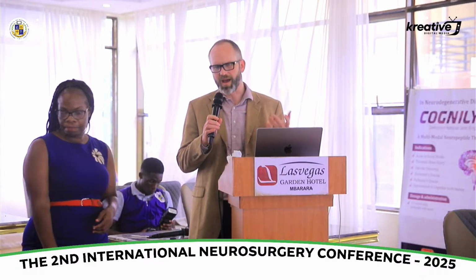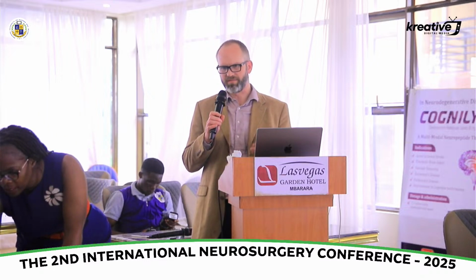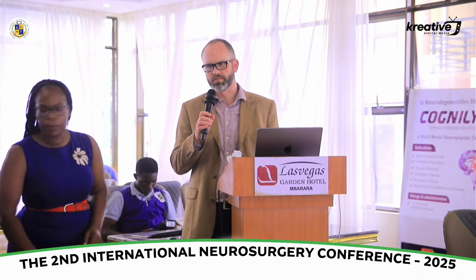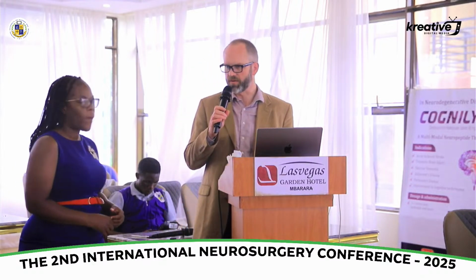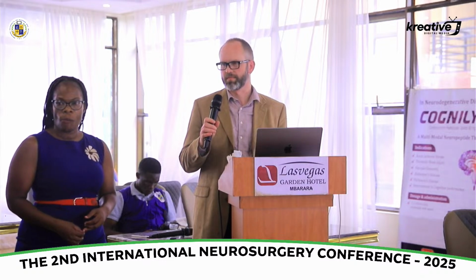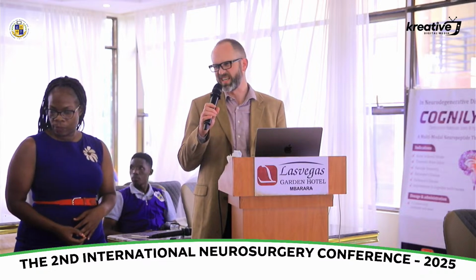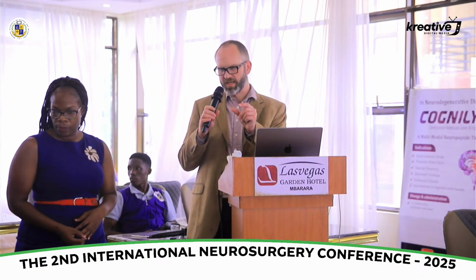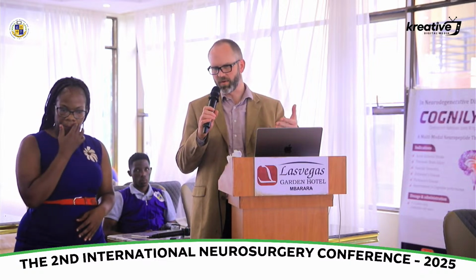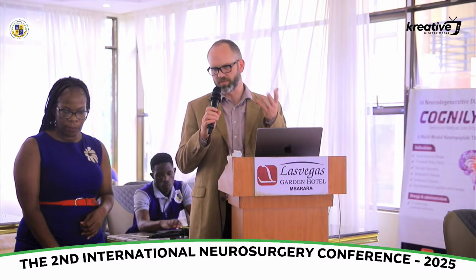And when you're in the operating room and the bone's off and the dura is open, you have superb ultrasound propagation. It works very, very well. You get a lot of attenuation through the skull. When the skin is injured, it swells. Certainly, if you're looking through the skin, it creates more attenuation because you have a thicker space between the skin and what you're looking at. So transcranial Dopplers would be a little harder.